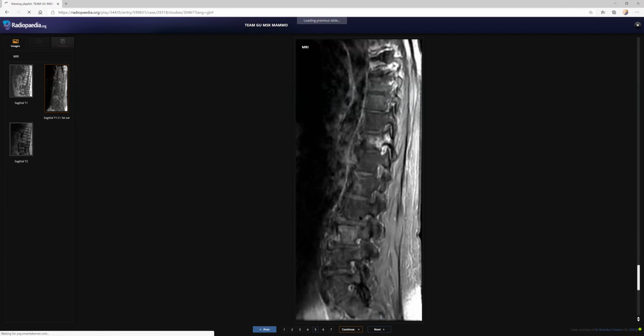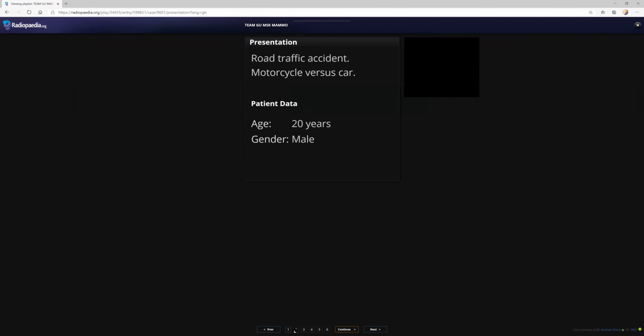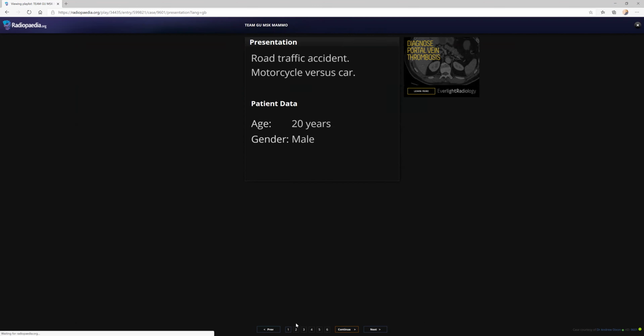Yes, contrast. You could have asked for the contrast, the stereo images and all. Only if you ask, you will get the films. Otherwise, you will not get the films.